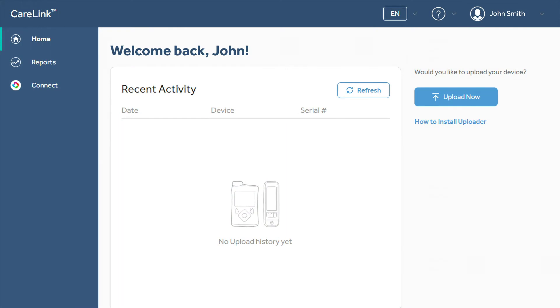Once you've logged in, you will be able to upload your devices, create reports, check your account settings, or see the CareLink Connect screen.